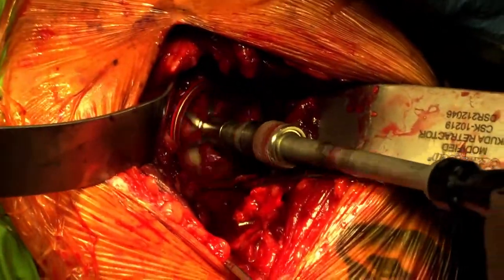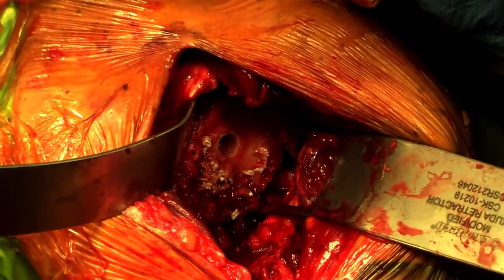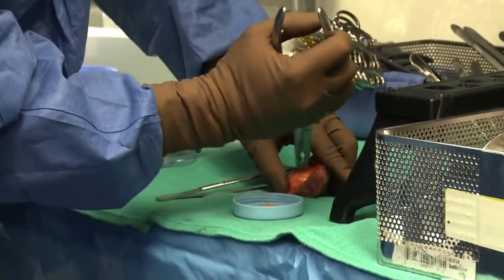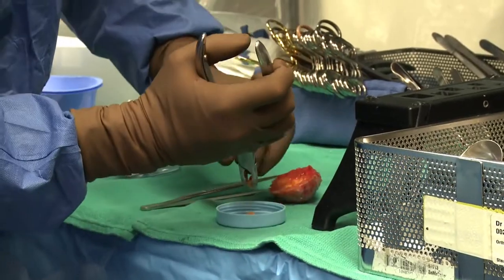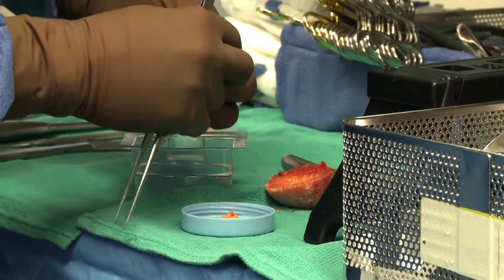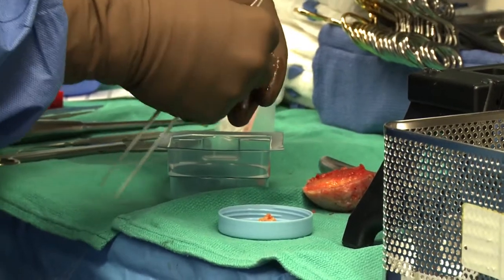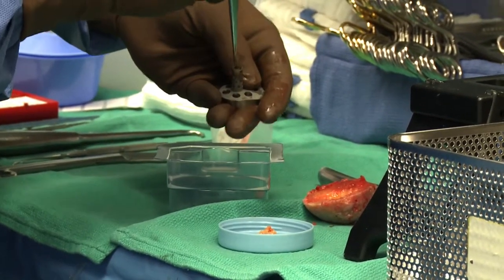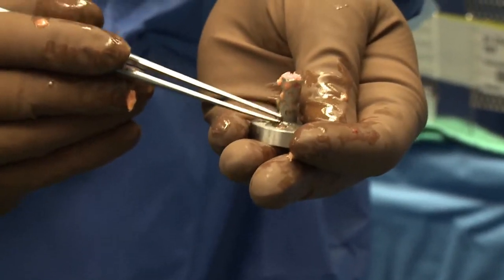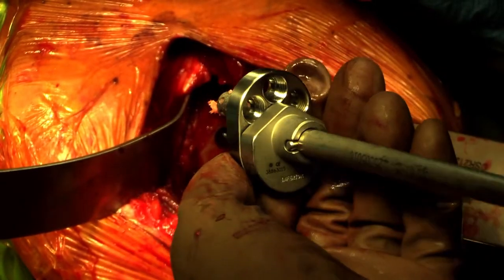Base plate implant can be opened. The center peg can be drilled through the drill guide or by using a freehand technique. Using the coring reamer or a rongeur, obtain the bone graft from the resected humeral head. Then, fill the central cage of the base plate with the bone graft material. Insert the base plate into the glenoid using the base plate impactor.